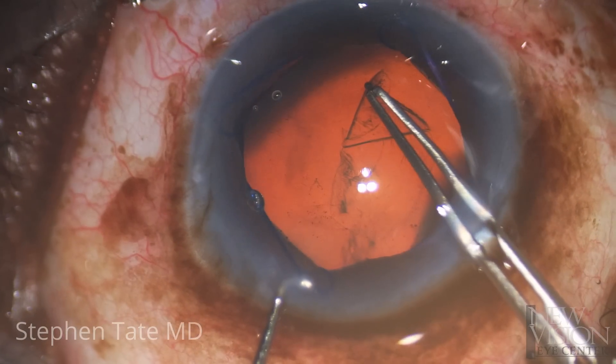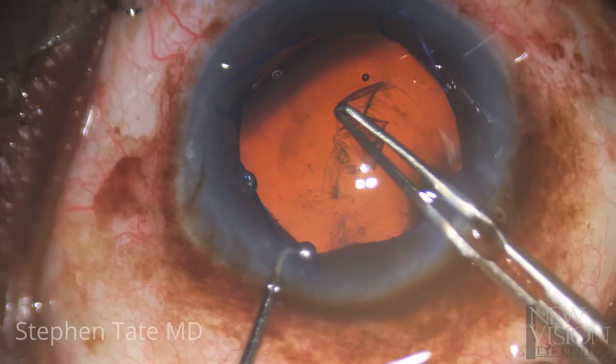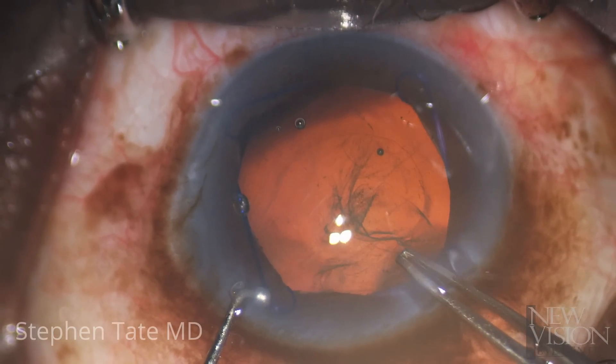In cases with zonular abnormalities, care should be taken to try to center the rhexis on the anterior capsule rather than on the pupil. In this case, the rhexis was completed without difficulty and laxity was only noted with force directed superiorly.